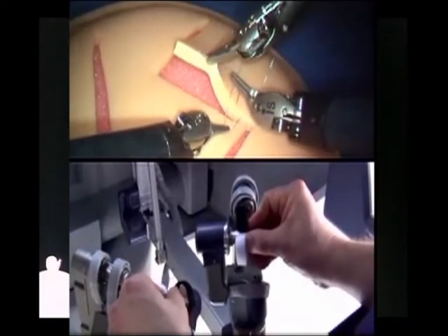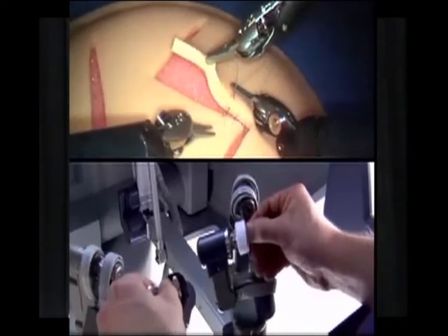And as I mentioned earlier, we are working in a deep dark hole where magnification is more than welcome. And light. Yes, absolutely. That's the biggest advantage. So how is the light problem settled or sorted out? Because we are using a lens which has fibers in it, which carry the light down to the bottom of the lens, and that gives a very good clear picture. Plus it's magnified.